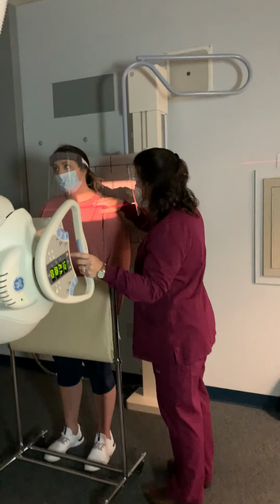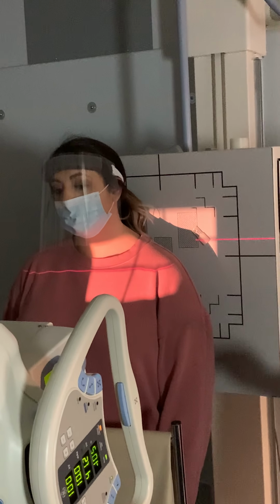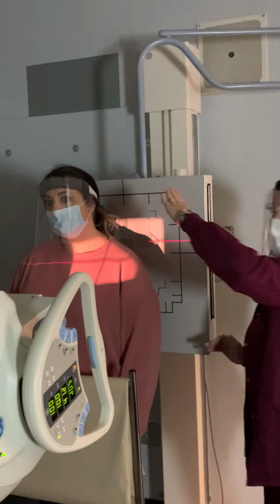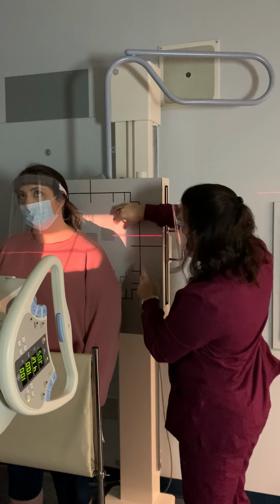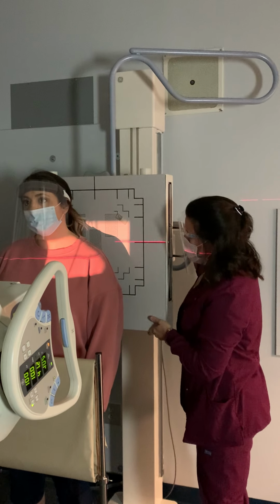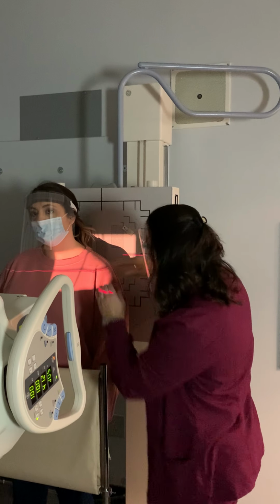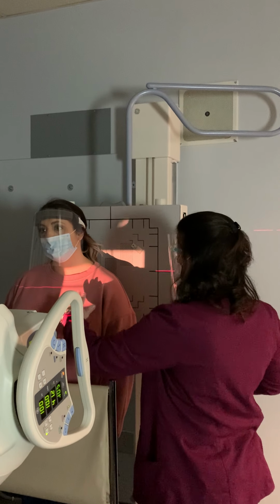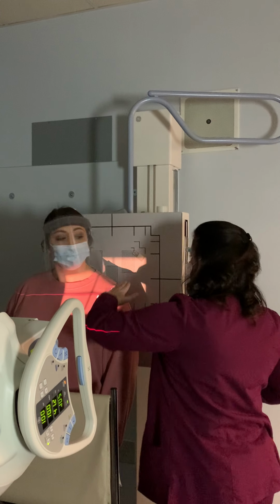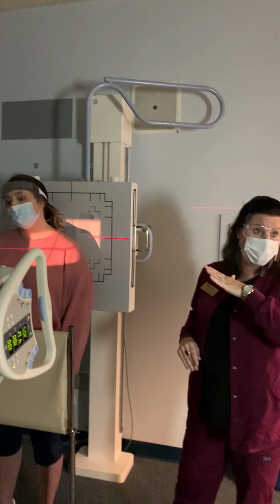Mid-clavicular area, I've got to include the entire clavicle. Here's the thing with this, guys. You're going to kind of come under the clavicle. You're not shooting right into it, because now our beam is going like this, right? So we're going to come down. Look at your exit on the IR. Look where your central ray is coming out. So I'm pretty close. I'm going to come down just a little bit more, because my beam is going to go up and through the clavicle and out to the IR. So you got to come a little bit below the clavicle because of the angle of the tube.